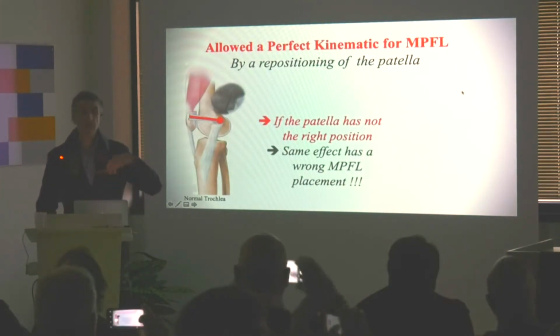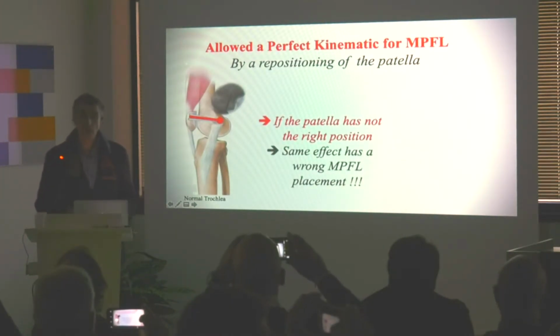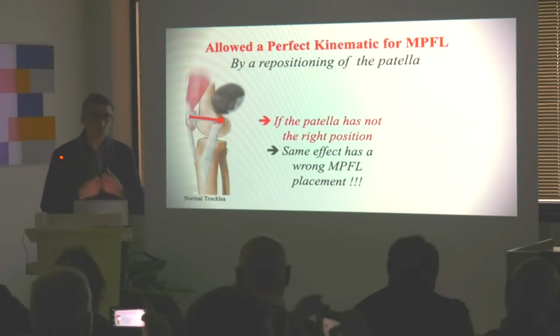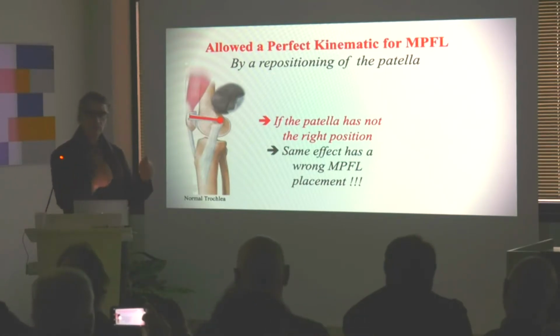Just to understand, if you want your MPFL to work well, you have to position your MPFL well, okay? So you take the fluoroscopy, you do everything, you put the best MPFL you can do.